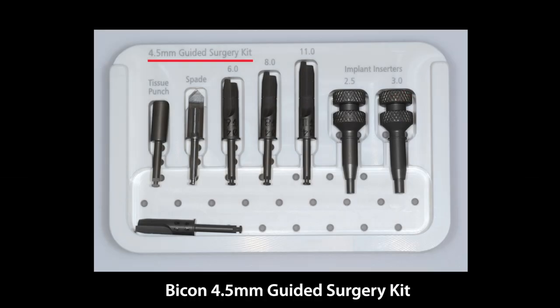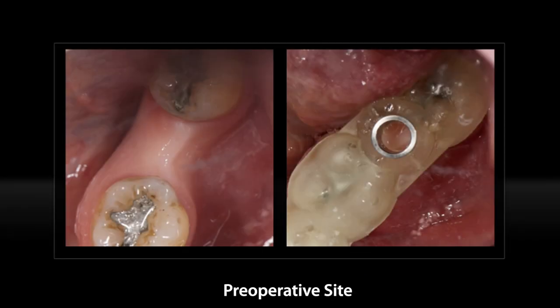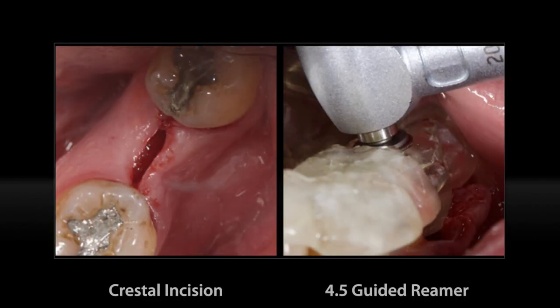So this is the Bicon 4.5 guided surgery kit. And this is a pre-operative photo showing buccal concavity and lack of keratinized tissue on the buccal side. So we decided to perform a crestal incision instead of a tissue punch to preserve the keratinized tissue and to allow for buccal bone grafting. Widening the osteotomy using the 4.5 by 6 reamer from the guided surgery kit.